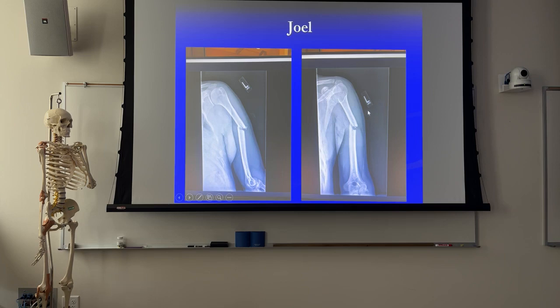So what do we have here? It was a worker who fell on a job site and came in holding it like this - he was Spanish-speaking. He said he didn't want to stop working. Some of your patients will do whatever you tell them to do - a broken shoulder, you tell them to do something, they'll grit their teeth and just get after it. Looks like you just got the lateral of the lower half, and the upper half stayed the same. That's a great observation. What we see here is the greater tubercle. What you've got is a lateral of the distal end and an AP of the proximal end.